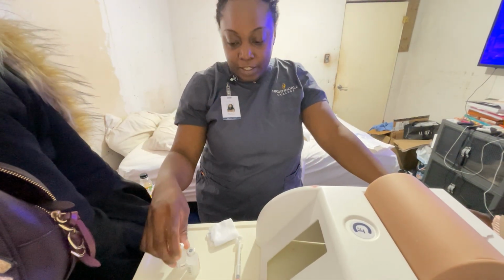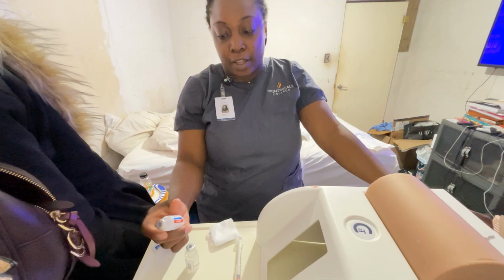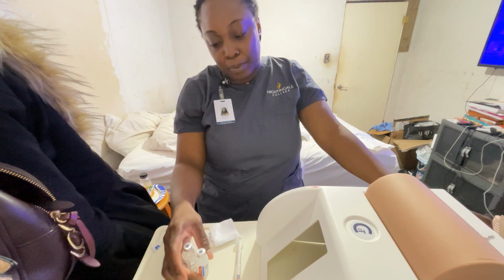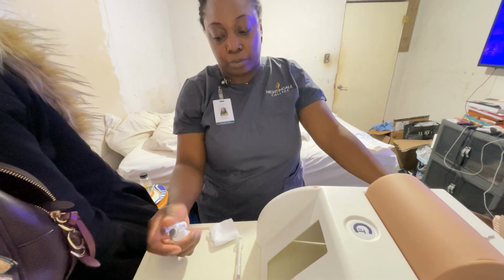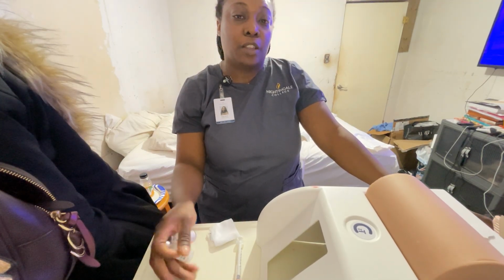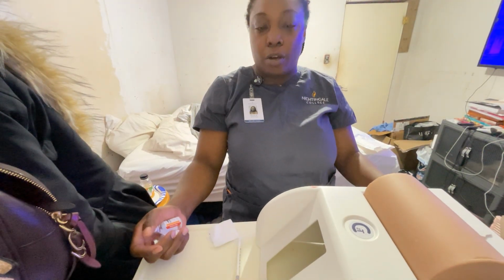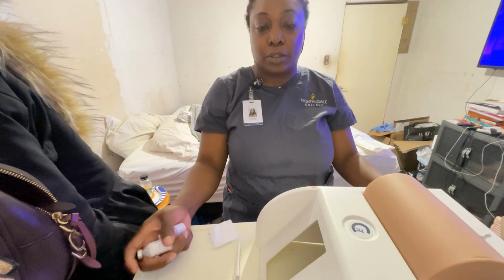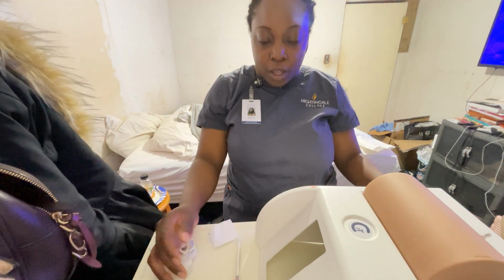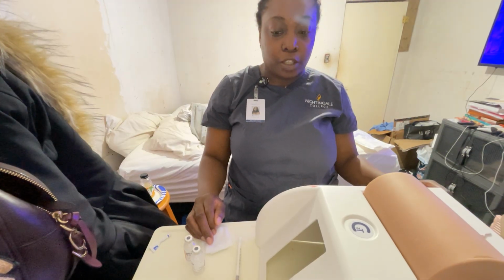And the two medications that I do have, again, is one is an NPH insulin. Let me back up here, insulin is to treat blood glucose levels to ensure that they get enough glucose to the cells of the body. So, having the appropriate amount of glucose is vital for survival and cellular respiration. I'm going to check my patient's blood sugar levels.